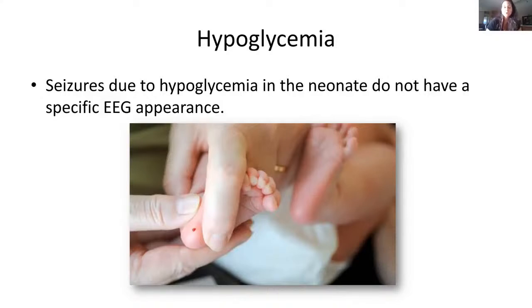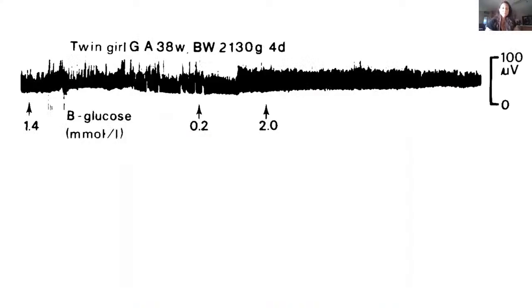I think that it's going to be exciting work when they publish that, so that we can begin to see what's actually going on. So this is in international units. So for those of you watching from international units, you'll know what this means. But basically, lower numbers are bad, right? So just like with our milligrams per deciliter. So you can see here, this aEEG is pretty suppressed. And then you can see these lower values, so 1.4. And this low flat tracing, so that's the continuous low voltage. And then starting to see some disruption.